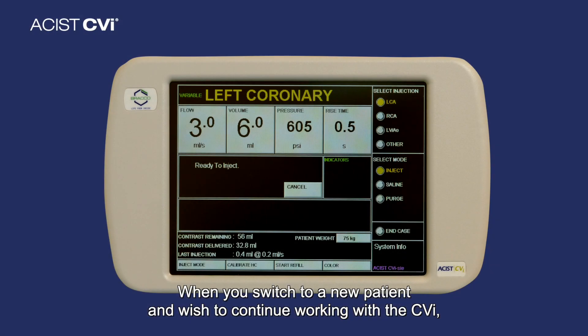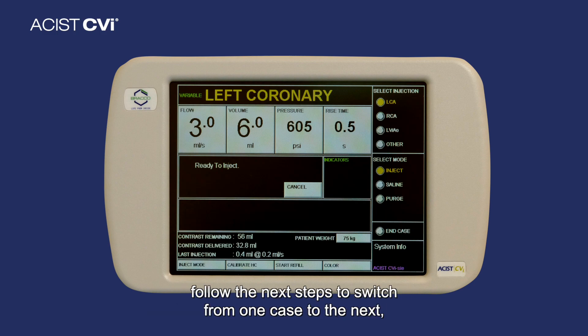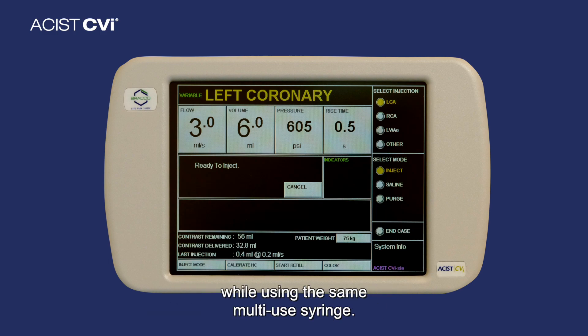When you switch to a new patient and wish to continue working with a CVI, follow the next steps to switch from one case to the next while using the same multi-use syringe.